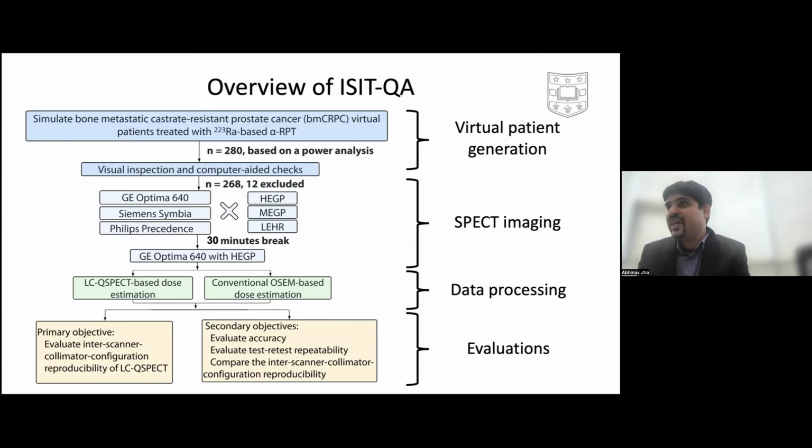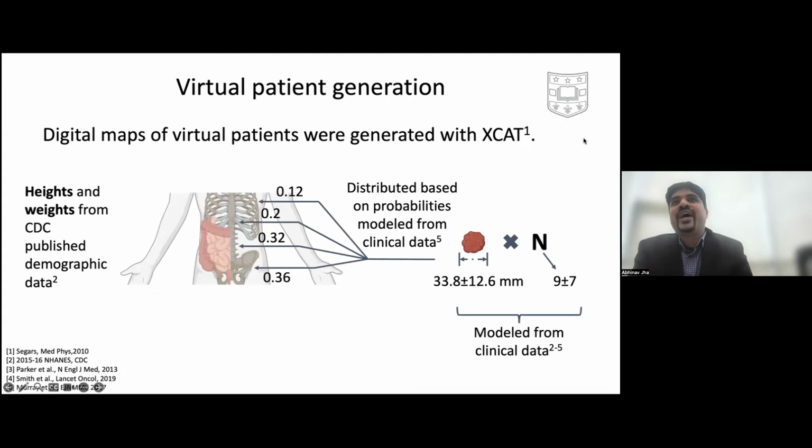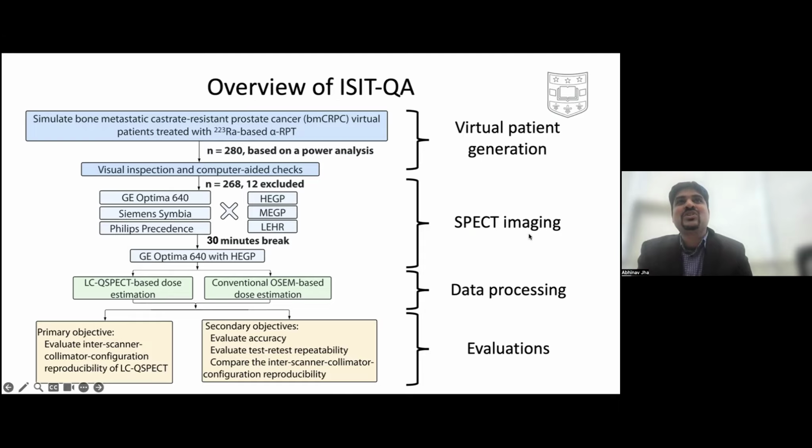So when you do an actual clinical trial, you have to exclude patients. You will see here that we sampled the diameters of the lesions from a Gaussian distribution. And what do we know about a Gaussian distribution? Sometimes the values can be less than 0 even, but sometimes they can be low. And so we set an exclusion criterion that if the lesion is below a certain diameter, we are going to exclude that lesion. There were some other things as well. Look at the patient, and there's some computational fault as well sometimes, but mostly this was our exclusion criterion. And in the JNM paper, we describe in more detail how we went about doing that.